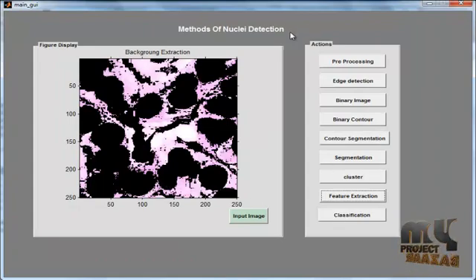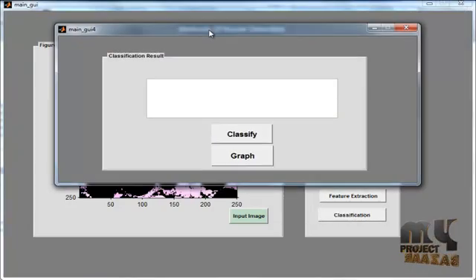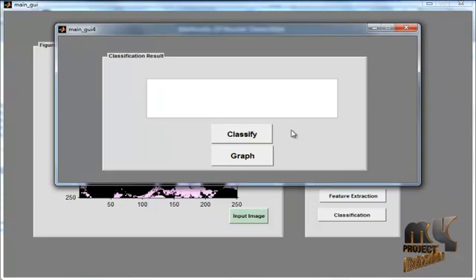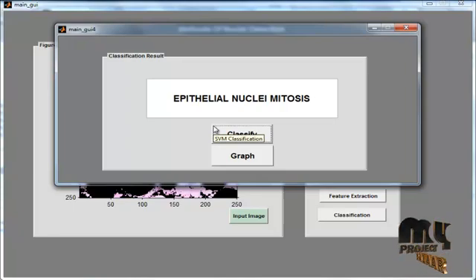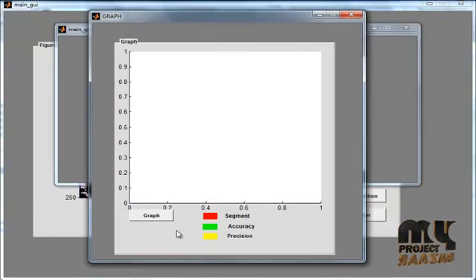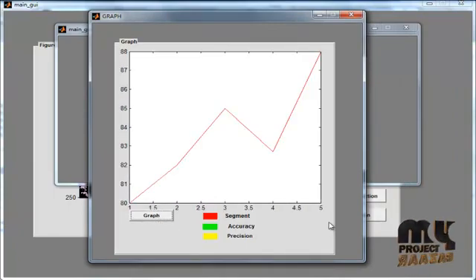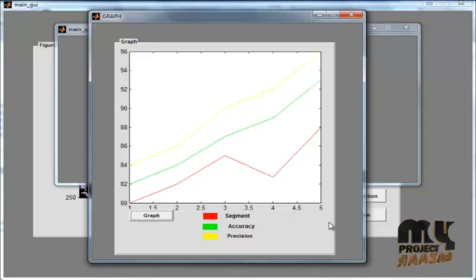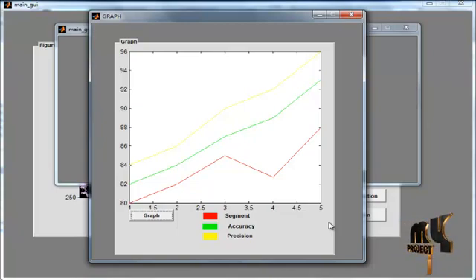Then click Back, and the main GUI will open. Then click the Classification button. After clicking Classification, the classification GUI window opens. In that window, we can see two buttons: Classify and Graph. By clicking Classify, we can see the type of nuclei and the type of diseases in the nuclei. Now click the Graph button. There are separate windows for the graph. We can see the graph for segmentation, accuracy, and precision. The red line indicates segmentation, the green line indicates accuracy, and the yellow line indicates precision.